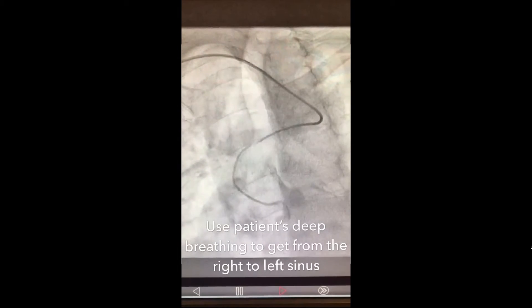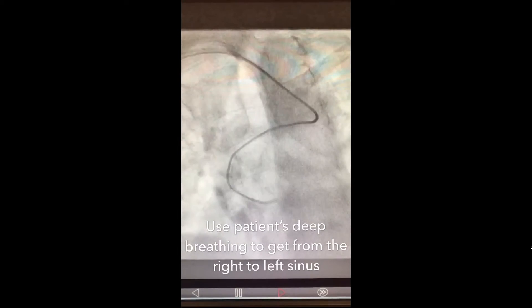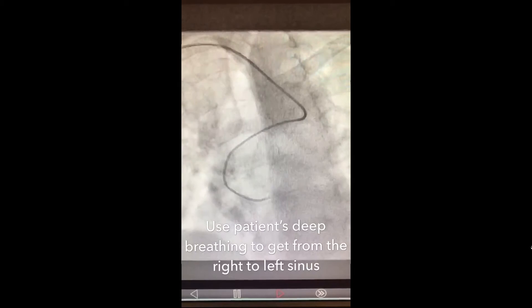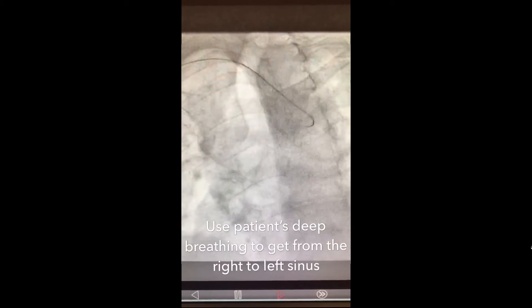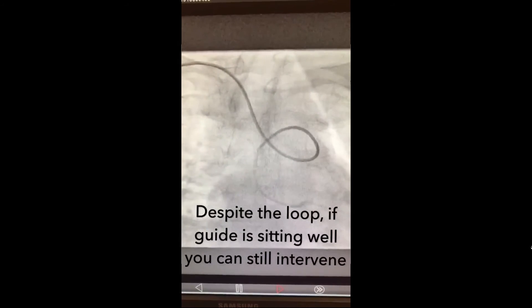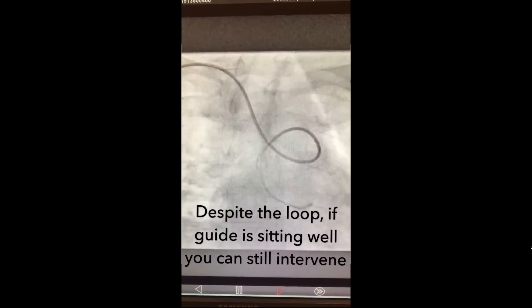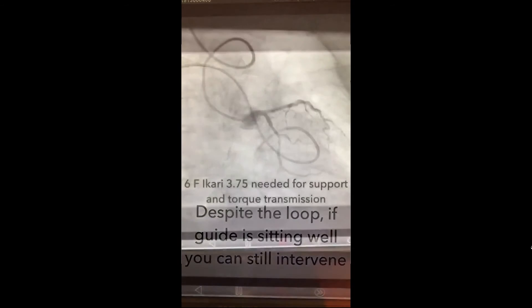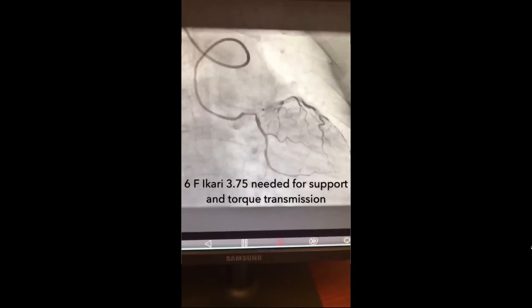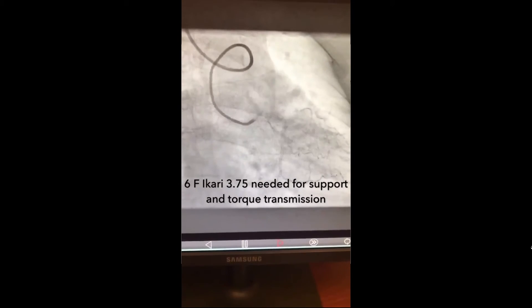Once the guide is in the aortic root, deep breathing from the patient would definitely help getting the guide catheter from the right sinus to the left sinus of Valsalva. And even with a double loop, you can still engage.